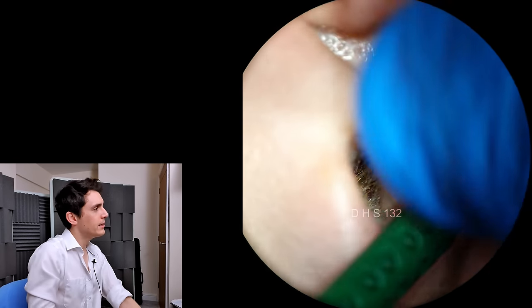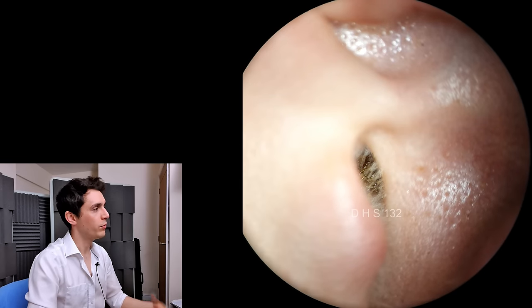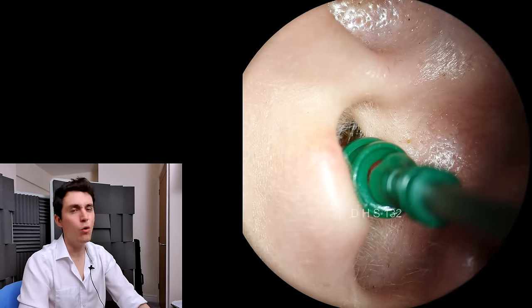We're going again, and these are two larges that I'm using. The green coloured ones are large, but they also make a medium, which is purple, and a small, which is blue.